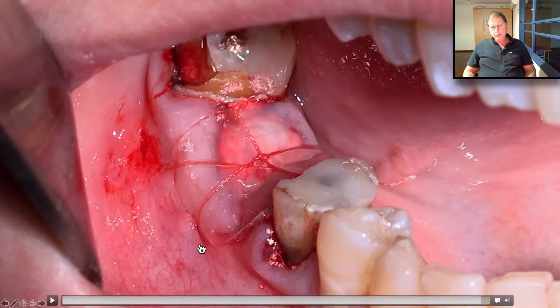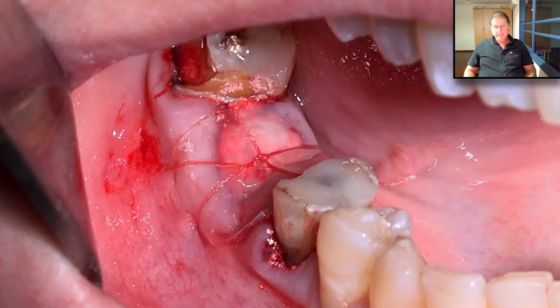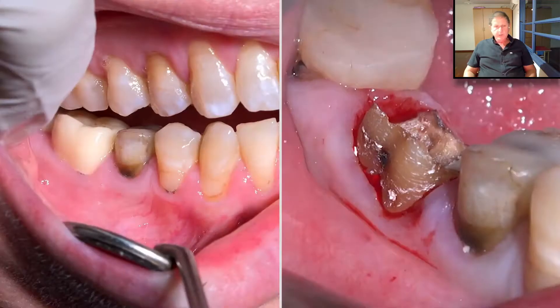Let me repeat how we suture it. After placing the Oraid and sticking it to the mucosa, we go down into the mucosa from the mesial side to the distal side, then go mesially to the lingual aspect, from mesial to distal, come back mesially and make our first knot. It's very simple. We don't need to go with the needle through the Oraid like with the collagen sponge — we just go above it and tighten it so the Oraid will not fall.